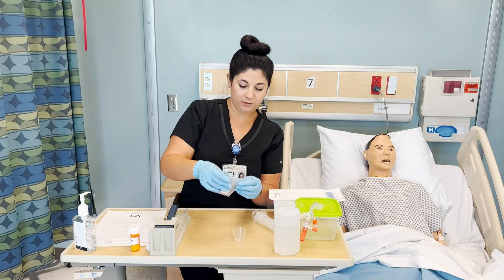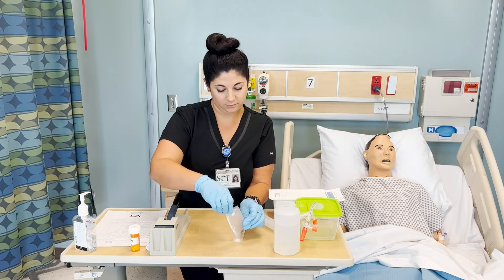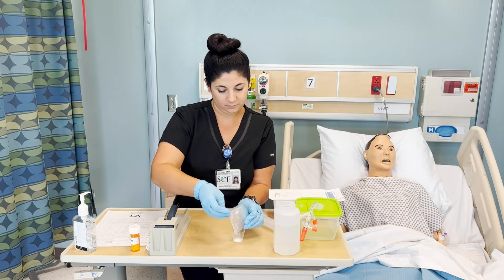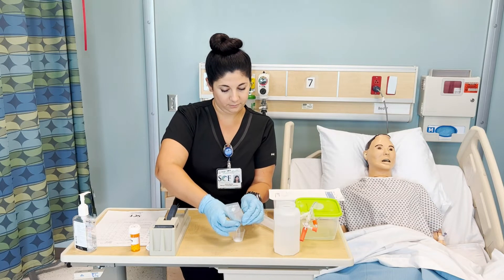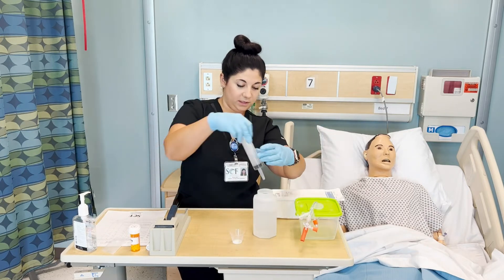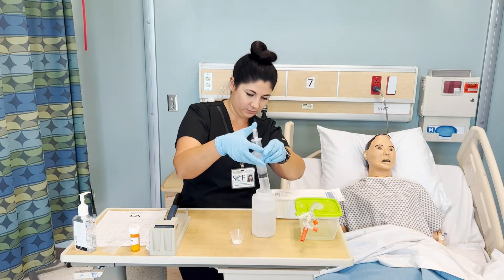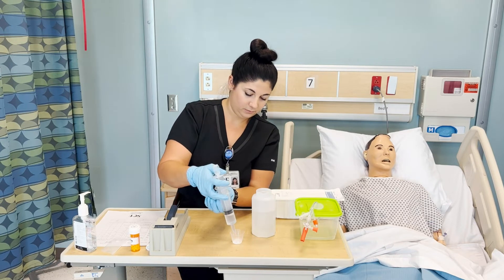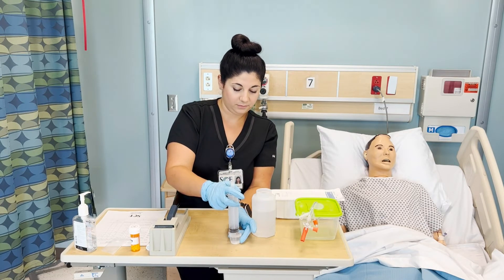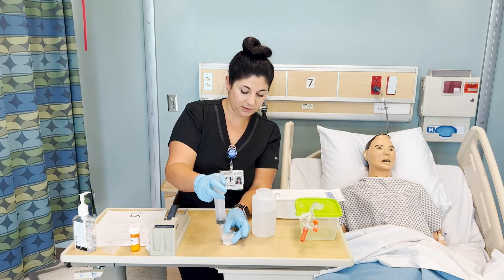You will then pour it into your cup, making sure not to lose any of that powder. And then mix it with at least 20 milliliters of fluid — we have water here. You might have to agitate it to really mix it, and you can let it sit there so it dissolves.